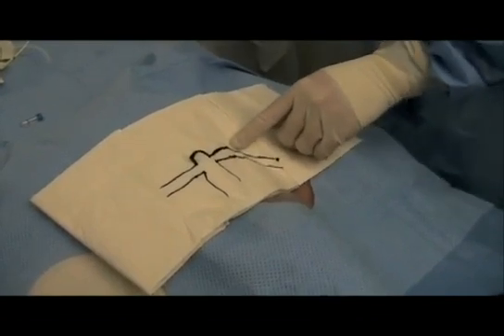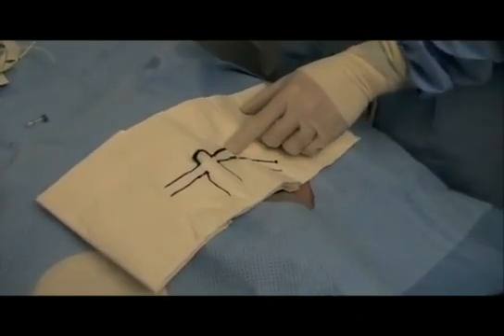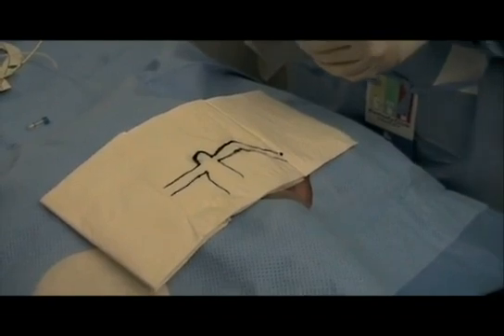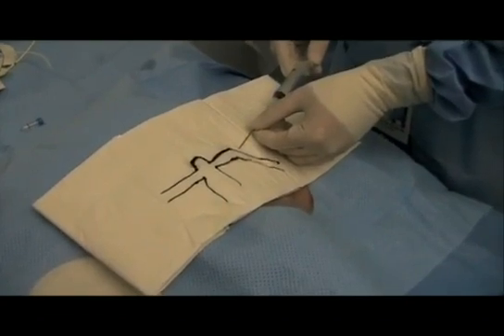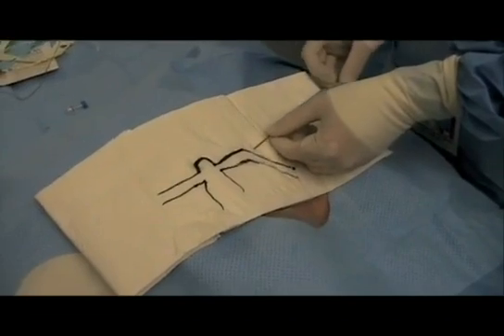But if you move out here, you'll find a nice easy spot where you can actually stick your finger all the way underneath the clavicle. That's the best spot to enter for your infraclavicular placement. What I'll actually do is find that spot, feel it with my finger, and do my skin puncture about a centimeter away. This gives me time to actually get through the skin and transition underneath.